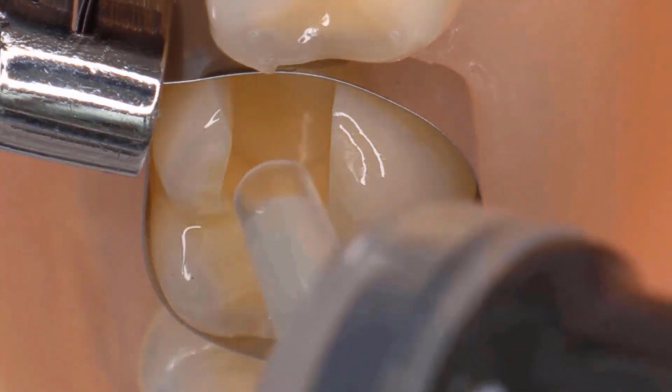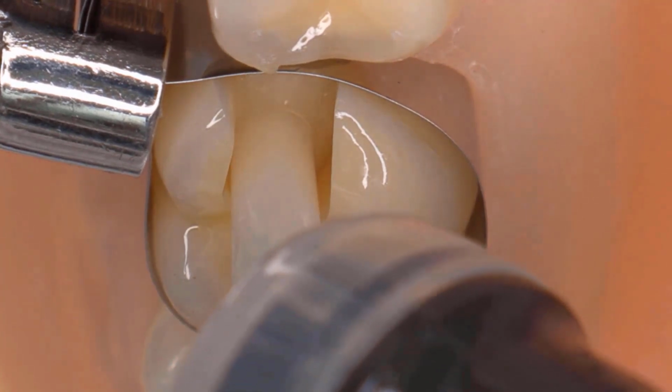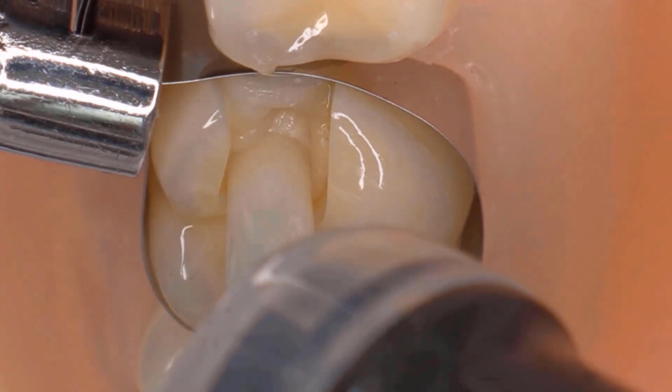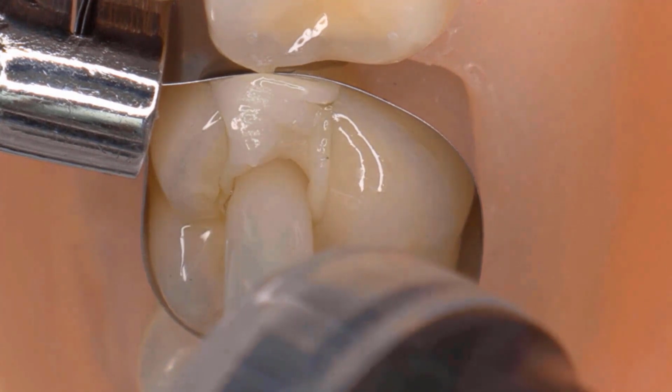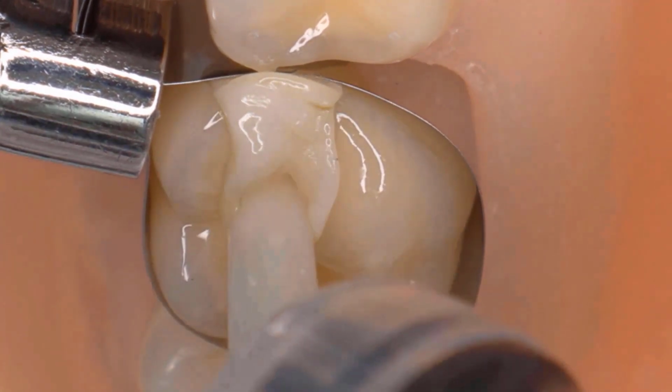Fill the cavity to full volume, and it would be advisable to overfill the Cention Forte material as you would do with an amalgam or glass ionomer based restoration prior to sculpting. When filling the cavity, it is vital to submerge the tip end of the capsule under the material surface to prevent any air bubble formation.